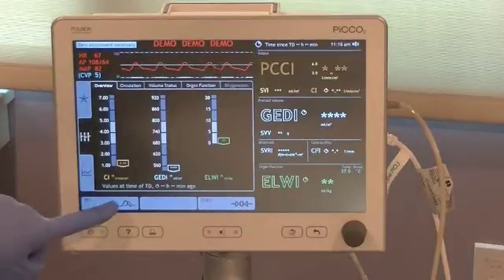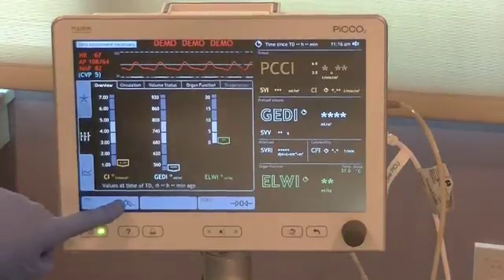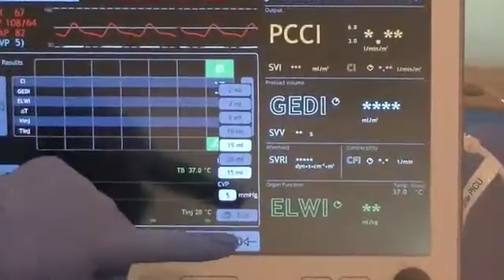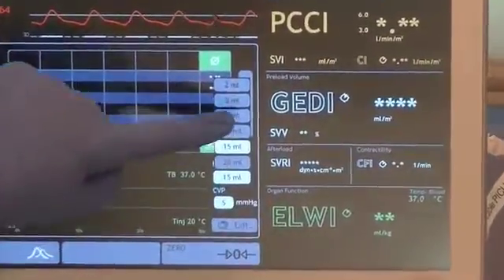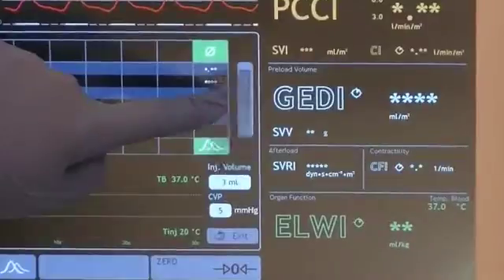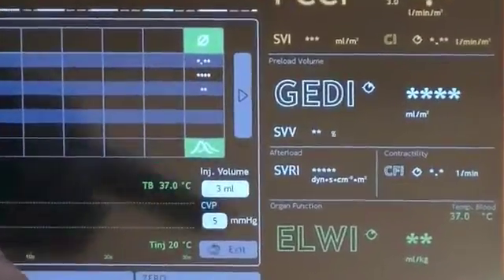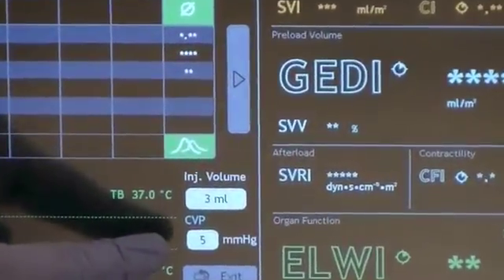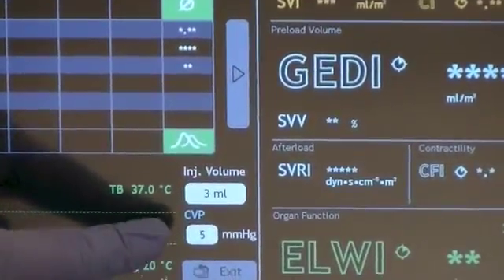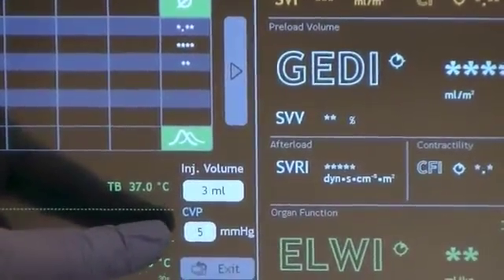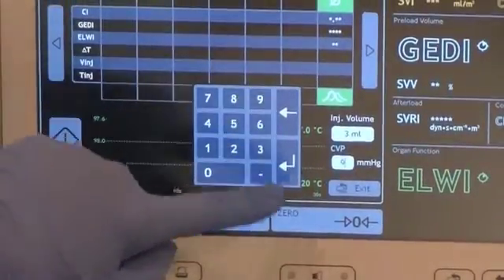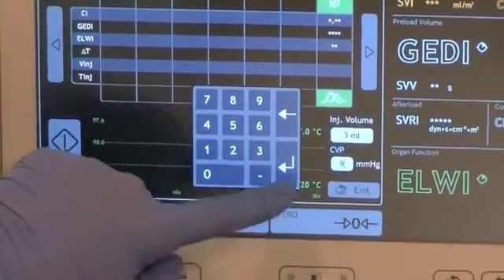First, press the TD direct access button. In this thermodilution screen, set the volume of the injectate that will be used. Next, enter the patient's measured CVP. Confirm by pressing the Enter key.